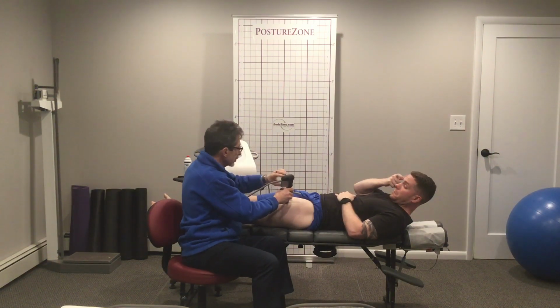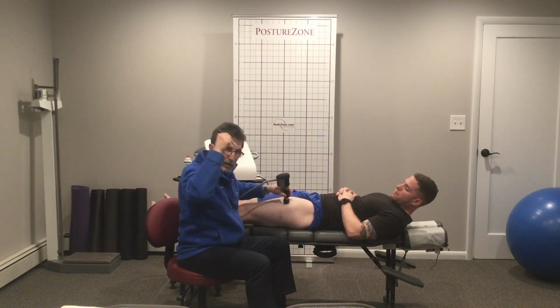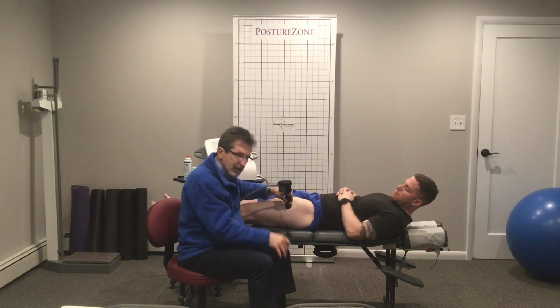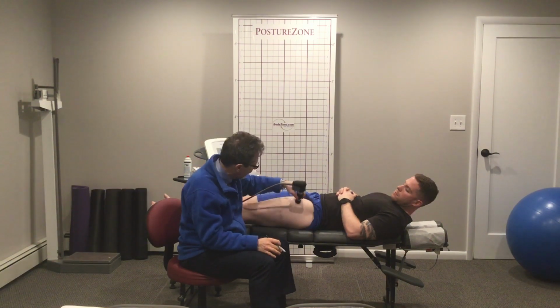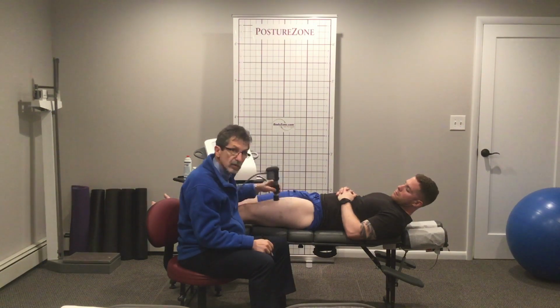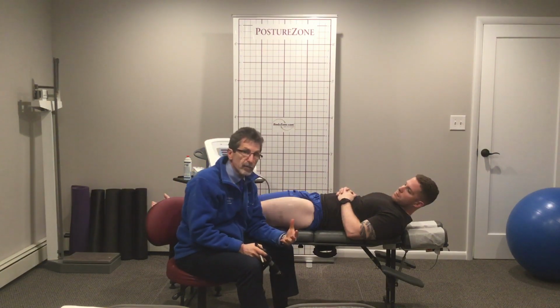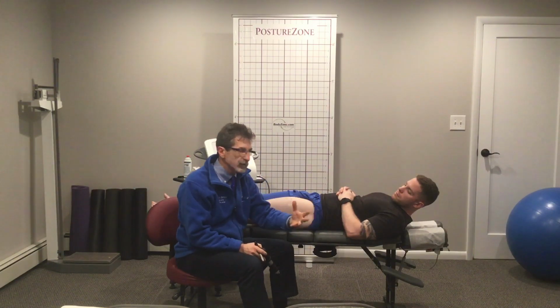Because by increasing the hertz, going faster, you don't get as much depth because the tissue can't fully rebound. It's kind of weird, but that's how it works, all right? So by going faster, the pebble's not going in as deep. The waves are getting shorter. I'm a surfer, so we talk about the frequency of the swell, right? The more waves that are coming in, the less power there generally is. The longer the wavelength, the waves can really build and crash on the shore, as a rule of thumb.